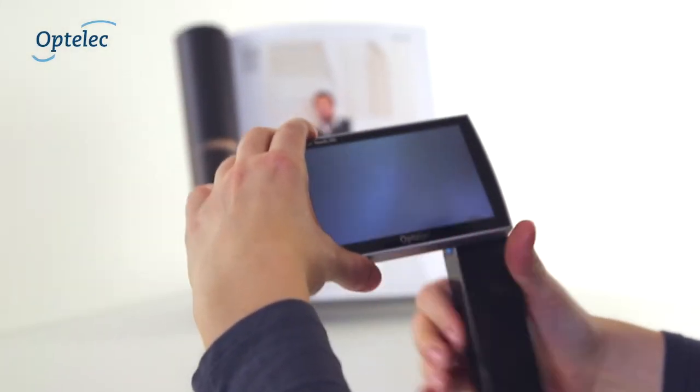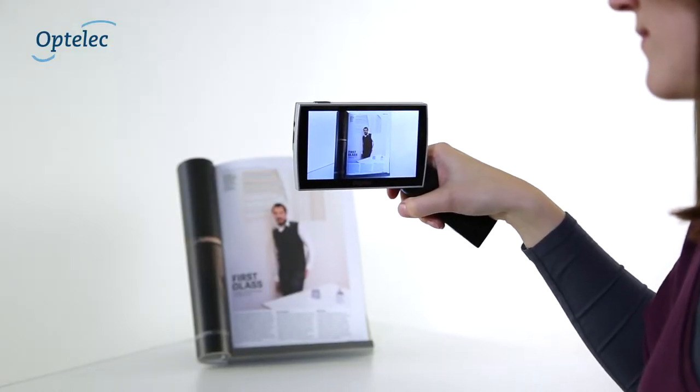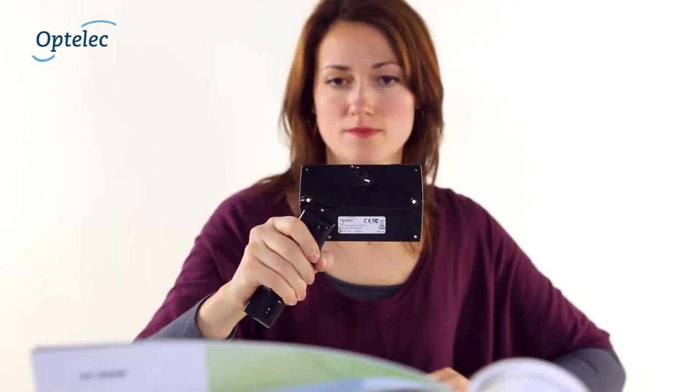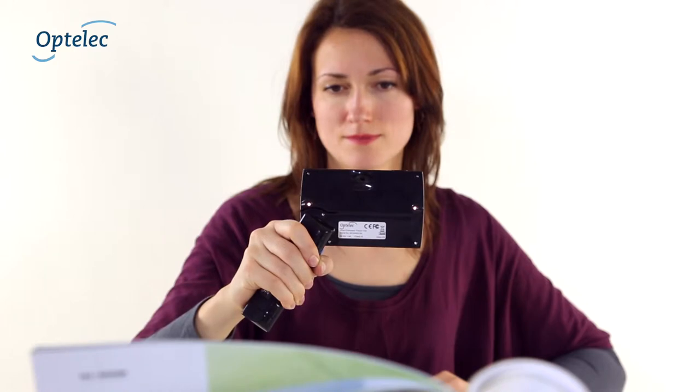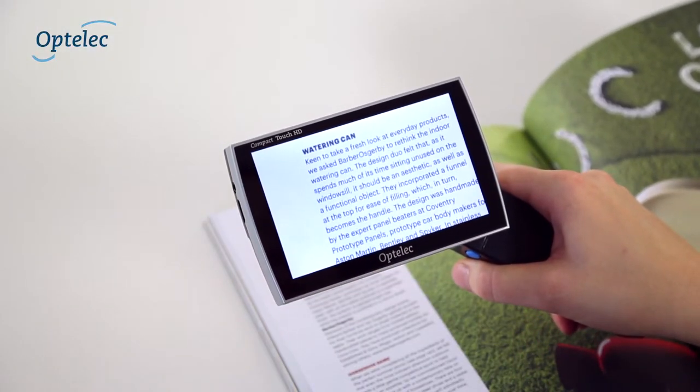You can easily rotate the foldable handle to the open position for added comfort. Open the handle and hold your Compact Touch HD effortlessly towards distant objects or text. By tapping the screen, you can focus the camera on things you want to see sharply.